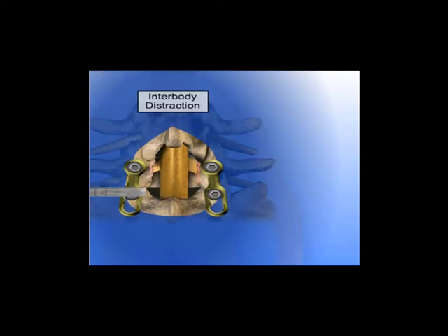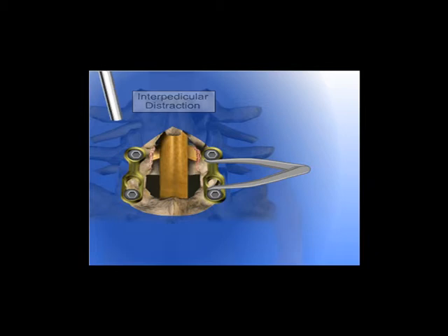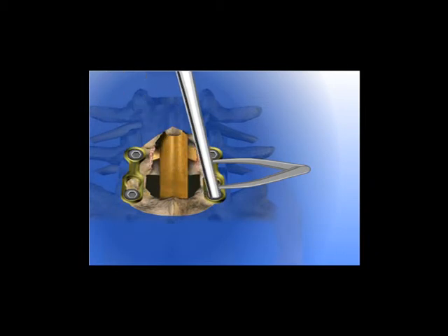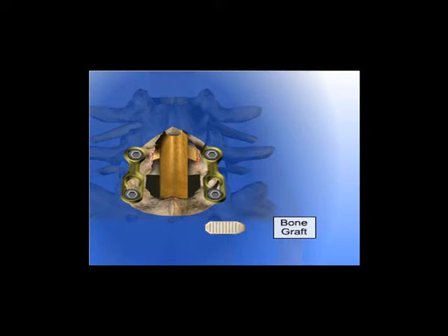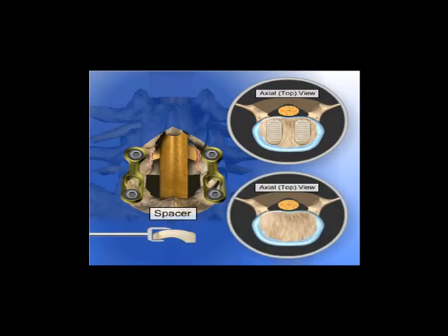To prepare for bone graft insertion, the disc space is spread apart by moving the vertebral bodies or applying pressure on the pedicle screws. The screws are tightened to hold the disc space in this open position. 2 bone grafts are then placed between the vertebral bodies. The bone grafts allow for eventual fusion as bone grows beneath the vertebral bodies. In variations of this procedure, spacers, cages packed with graft material, or ground bone graft material may also be packed into the disc space to aid with the fusion.